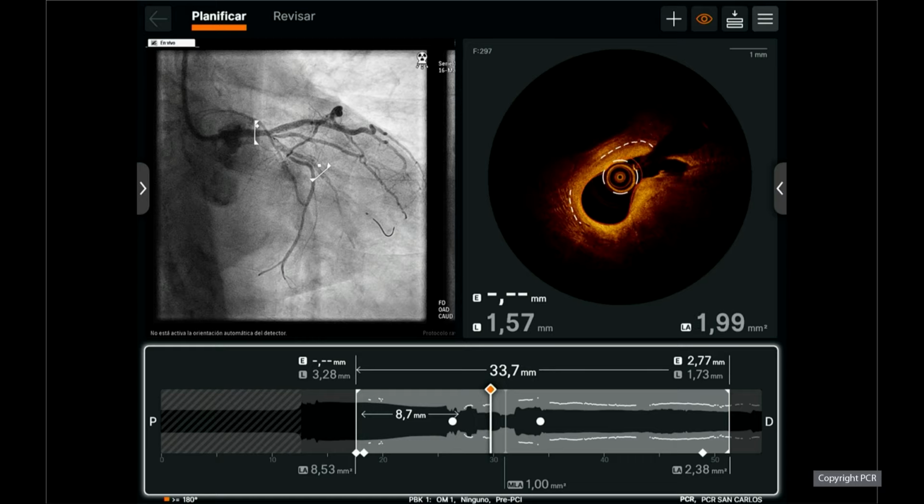So you can see here, we are now in the distal left main, where you can find there are some areas still with calcium, as expected, as we saw in CT. There is calcium also here, extending from the left main to the circ. If we go a bit more proximal, there is an area that looks a little bit healthier. For example, around this area, and this could probably be our landing zone.